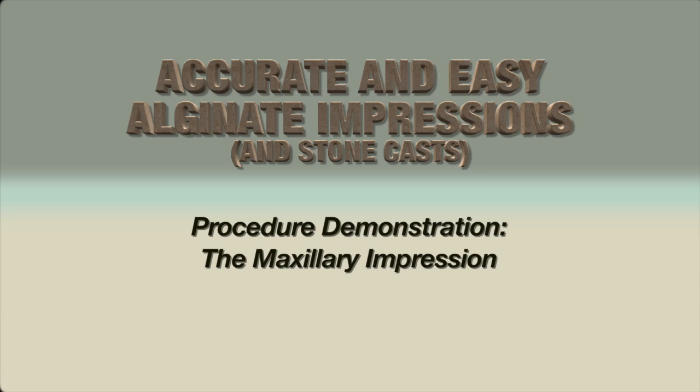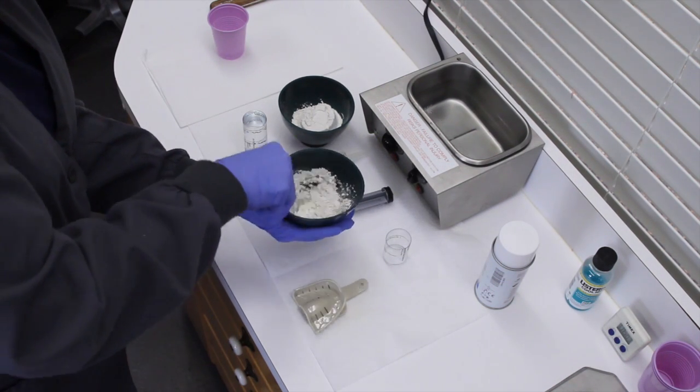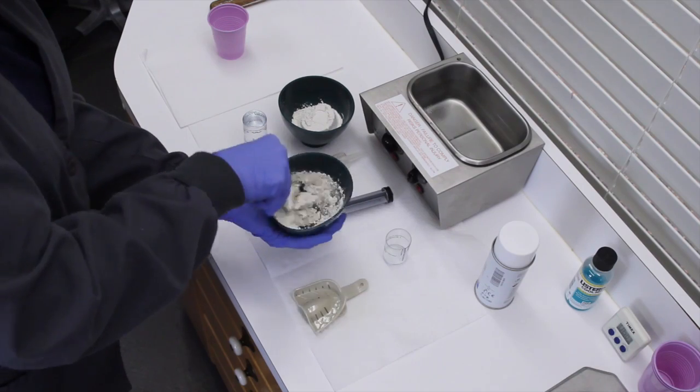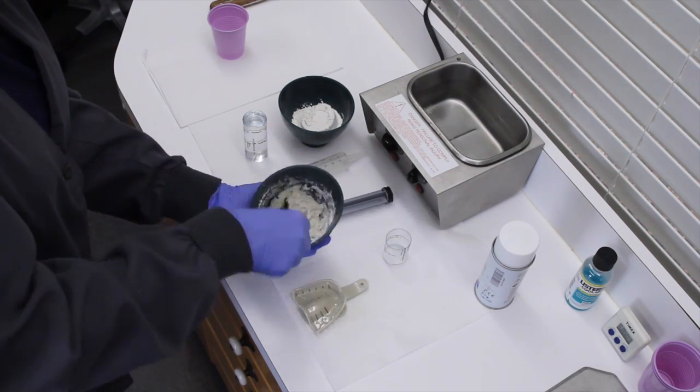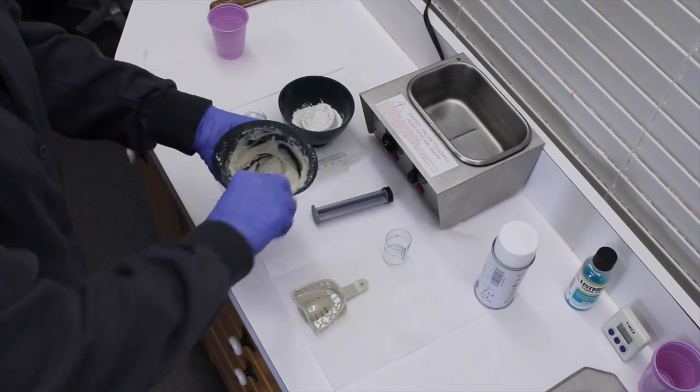Okay, with all preparation work done, we're going to get started on taking our upper impression. Some discussion is whether you start with the upper or lower. I prefer the upper. It's certainly a personal thing. I like to get the more difficult impression for the patient over with, but it's really up to the individual.